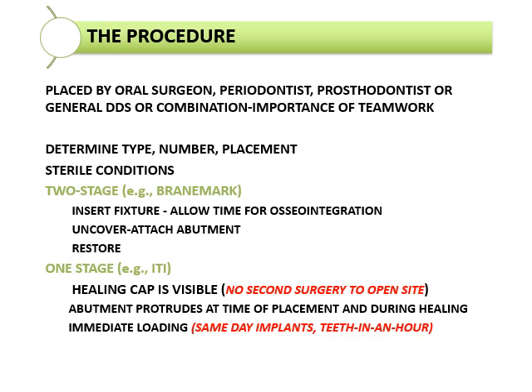The difference between the two, it just is a matter of opinion for the doctor. I have done some research where they say that the two-stage is better because the whole fixture is covered up, so there's less room for bacteria to get in around that fixture. So it's completely covered and it's healing without the chance of bacteria getting involved.